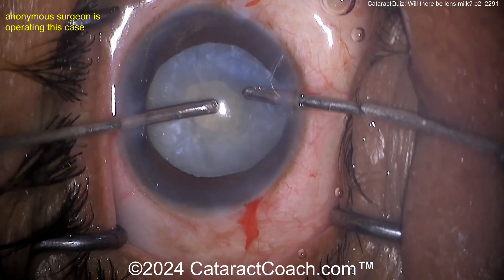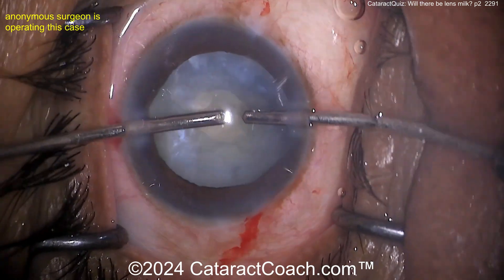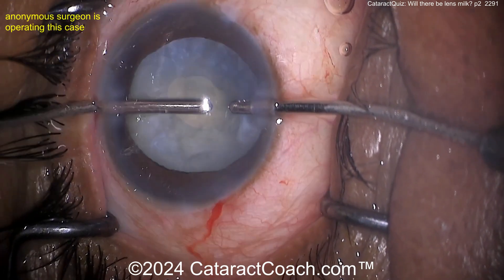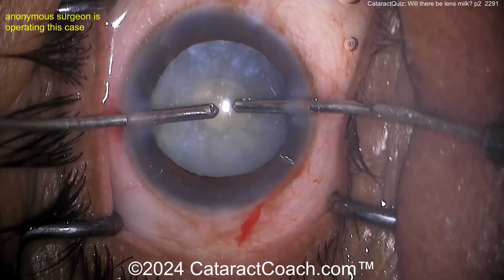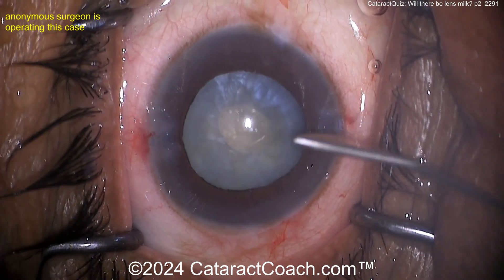That's going to make life a lot easier. Now it's depressed, going the other way too. Look at this thoroughness. This one didn't express a lot of milk, but this is the type of cataract that typically would have a lot of milk — and this is your risk for Argentine flag sign. Doing this double rhexis technique — great job.